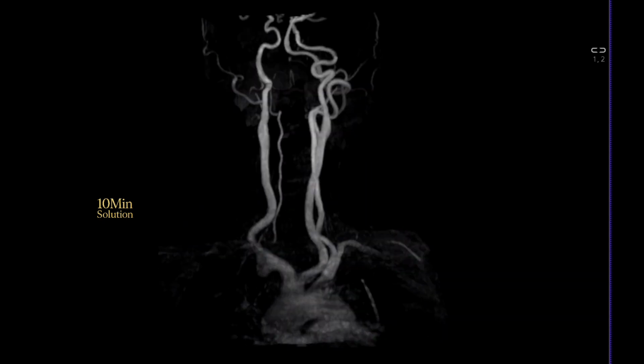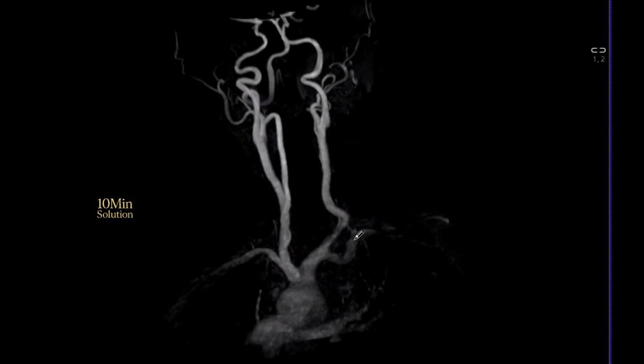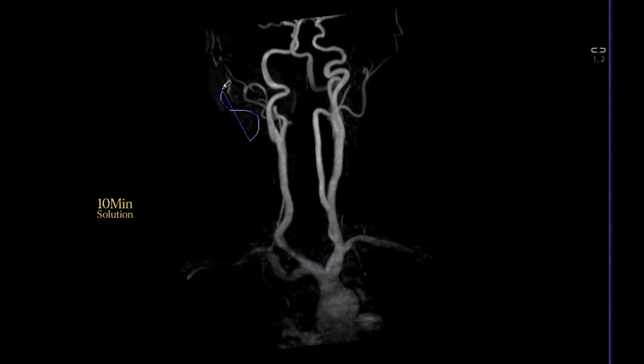Planning. Planning is the most critical step for acquiring high-quality images. Start with localizer sequences in 3 planes: axial, sagittal, and coronal. Carefully align the imaging slab from the aortic arch up to the skull base. Ensure proper coverage of common carotid arteries, internal and external carotid arteries, vertebral arteries. Patient positioning should be comfortable and stable to avoid motion artifacts.